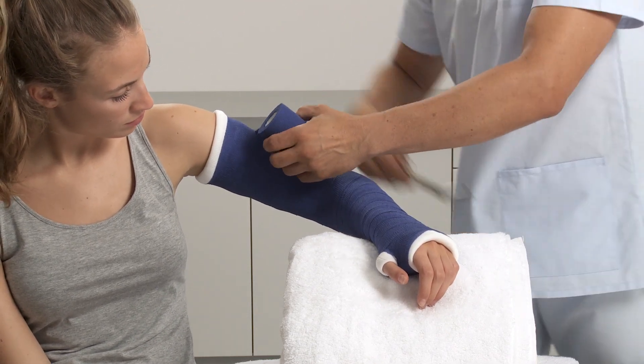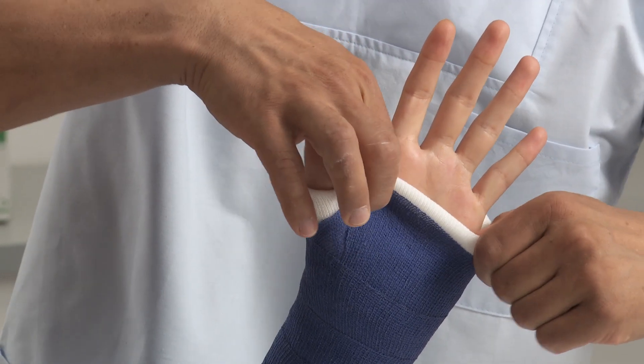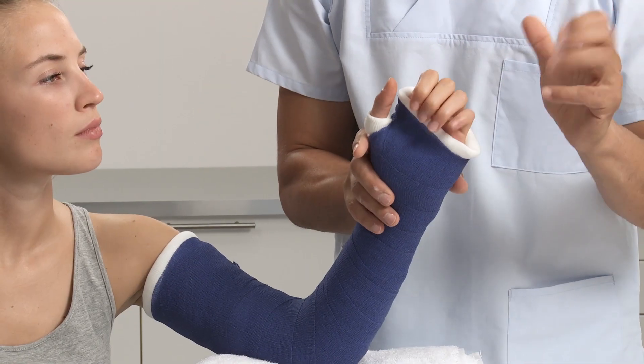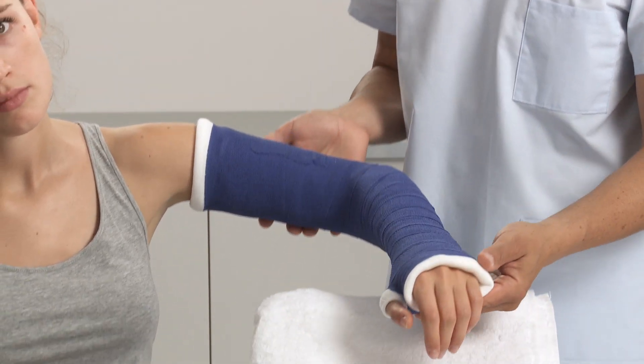Check the desired range of motion and any points that may cause irritation or pressure. After approximately 3 to 5 minutes, the splint is set and the patient can be released. After 24 hours, the splint is fully set.